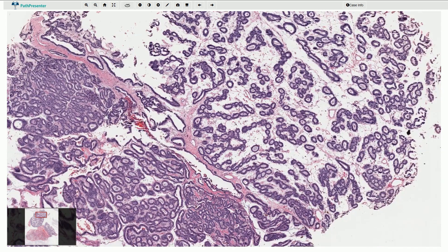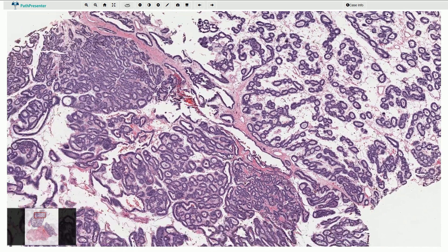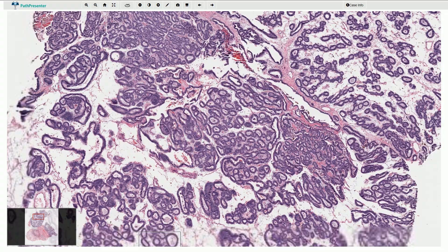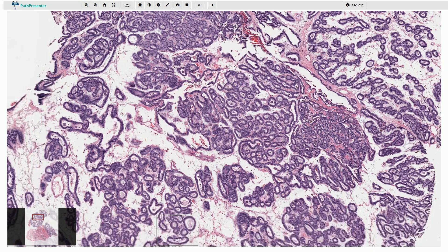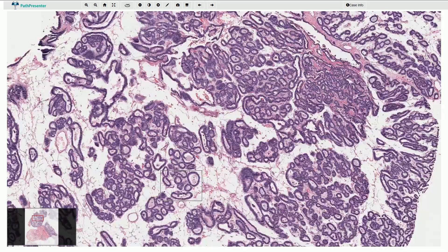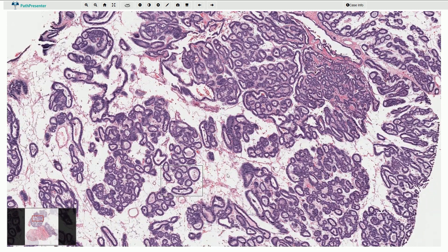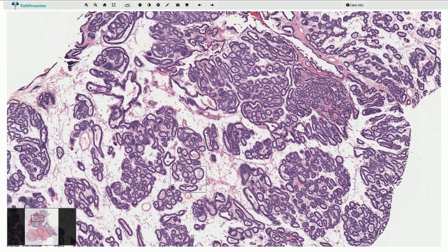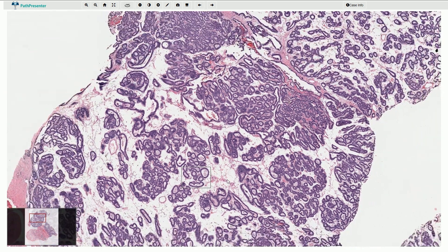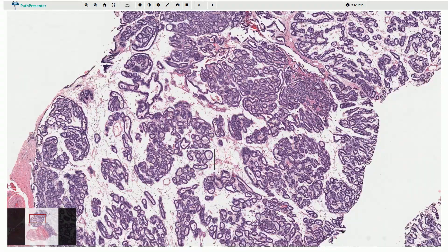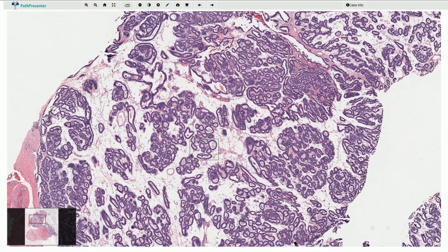The stroma is quite loose and sometimes it has a myxoid appearance, or slightly bluish myxoid appearance. In this case it is mostly very pale and light.